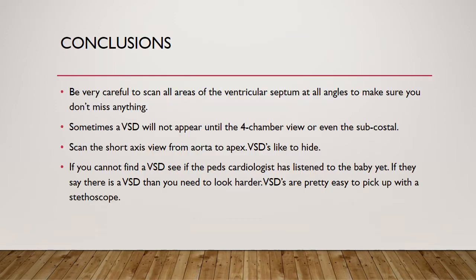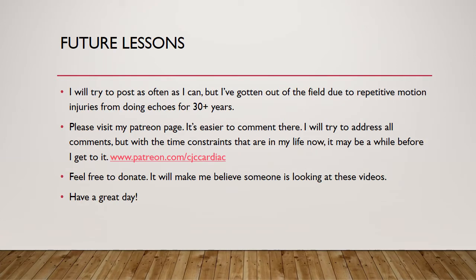Conclusions: be very careful to scan all areas of the ventricular septum at all angles to make sure you don't miss anything. Sometimes a VSD will not appear until the four-chamber or even the subcostal view — in peds we do the subcostal view first, so you sometimes get a shot at it right away. Scan the short axis from the aorta to the apex. VSDs like to hide. If you can't find one, check if the cardiologist has listened to the baby — if they say there is a VSD, you need to look harder, because VSDs are pretty easy to pick up with a stethoscope.